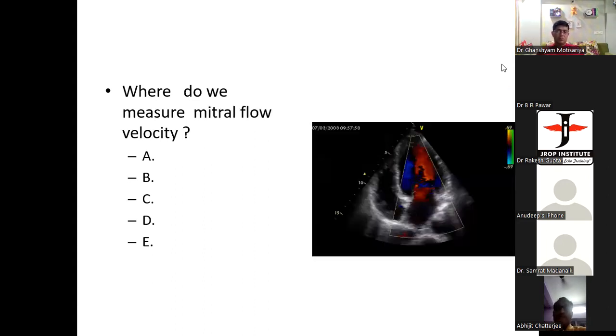Okay. Thank you, sir. Then Dr. Tamogna Das. Are you there, Tamogna? Sir, where do we measure mitral flow velocity? We can measure from the apical 4-chamber view, the apical 2-chamber view, apical 3-chamber view, and also from the apical 5-chamber view as well. Then, sir, we can measure from the subcostal view.